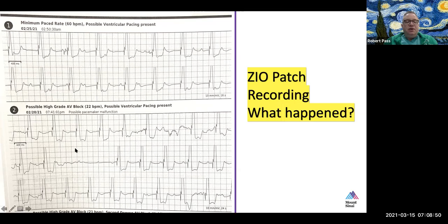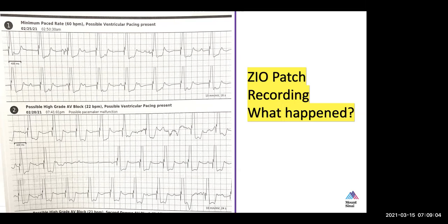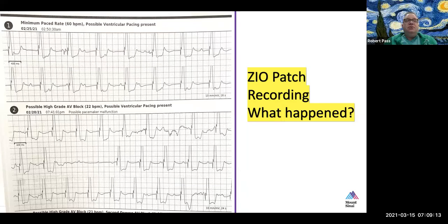And so, okay, now you know the device is oversensing something. So how would you adjust the pacemaker, or how could you fix this? What would be your troubleshooting approach? I could increase the number for the sensitivity, so decrease the actual sensitivity of the lead. That's right. You could make the lead less sensitive.